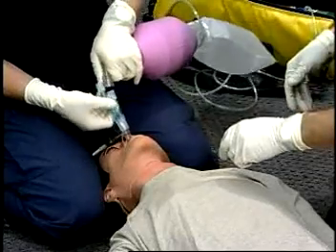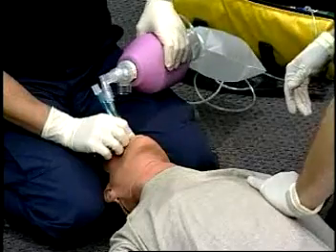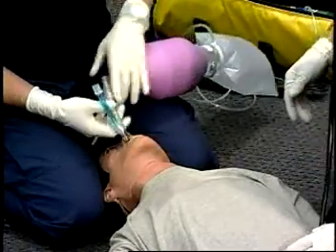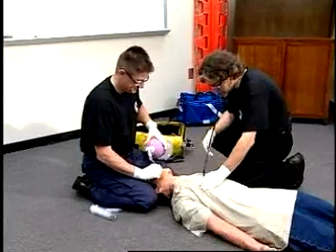If no breath sounds are heard with auscultation and gastric insufflation is positive, immediately ventilate via the shorter tracheal tube, which is labeled number 2. Confirm placement in the trachea with auscultation.